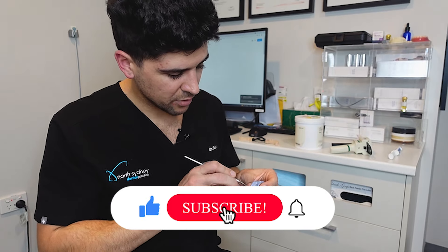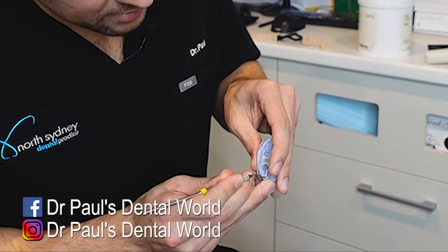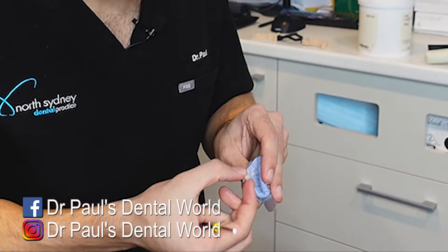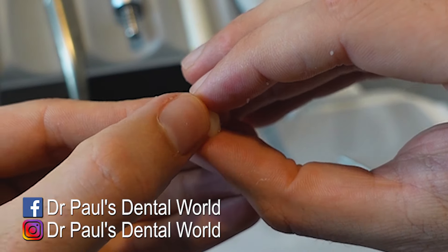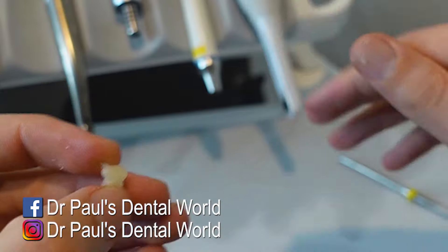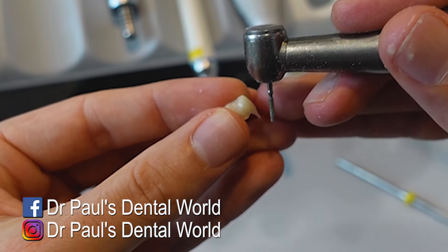Okay, so here's the crown inside here. And we're going to get it out. Normally I use a flat plastic or something, but basically you just go in underneath the crown and then slowly pull it out. So you can see there is some excess, which we're going to take away now with the burr. But this is how it's looking — it's looking pretty good.